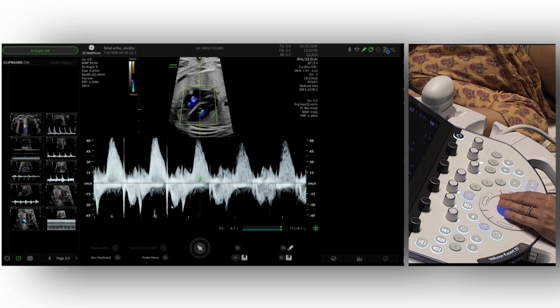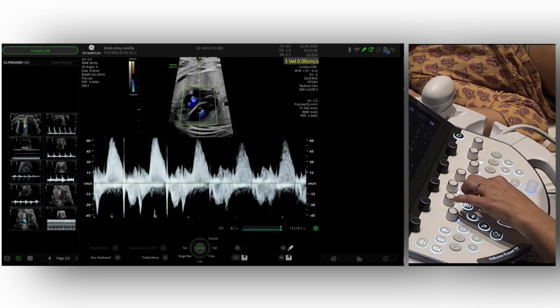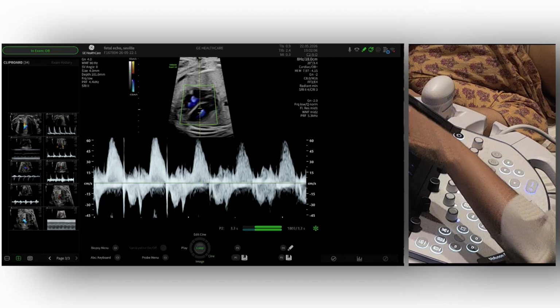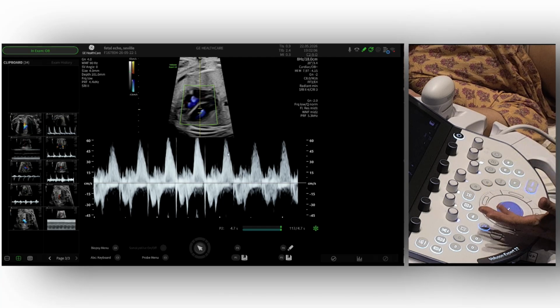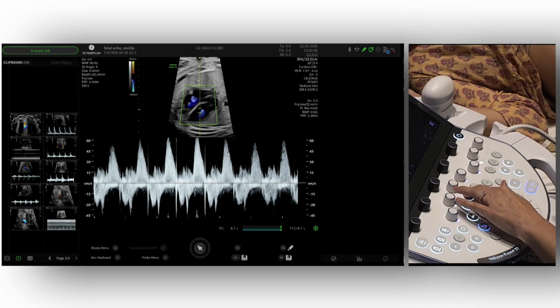That means that here we can do several things. So let's try to close this. We can first look if for each atrial contraction we have one ventricular contraction. You see that it's one atrial contraction, one ventricular. Atria, ventricle, atria, ventricle, atria, ventricle, atria, ventricle. It seems that it's 1 to 1, which is already very good, because we can have that for each atrial contraction we have a ventricular contraction.